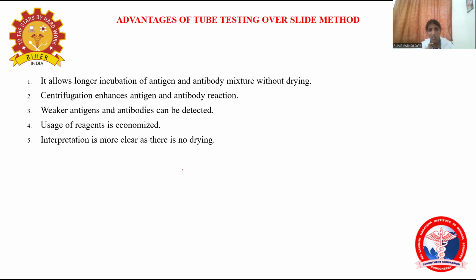Since the tube is longer and carries more blood, it allows a longer incubation of the antigen antibody mixture. What I mean to say here is, antigen in the red cell, antibody in the sera; when you mix them on a tile or a slide, it is easily going to evaporate and dry. It doesn't allow longer incubation for antigen and antibody to react. But in tube testing, it allows a longer incubation time of the antigen antibody mixture without drying the sample. So that is one of the major advantages.